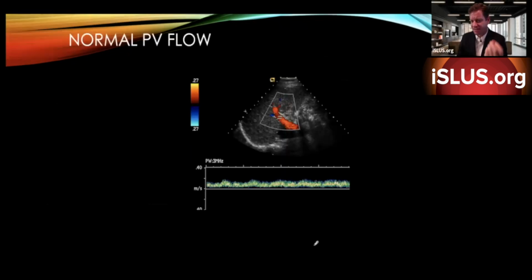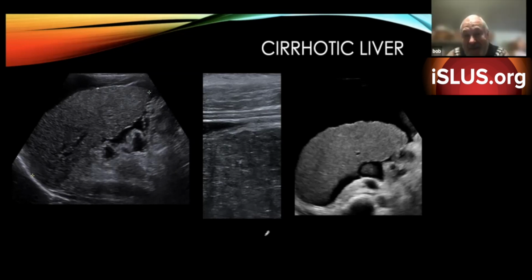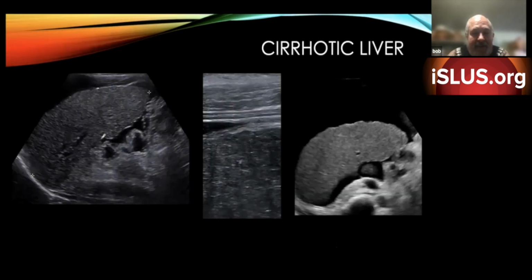And ascites is fluid, and on ultrasound, fluid shows up as hypoechoic, is what it's called in the sonographer world. Well, not really. Hypoechoic would be this: the kidney is hypoechoic to the liver. It sort of means less echogenic. There are no echoes in fluid, so we would say that is anechoic, without echoes. So black, every time we see black in ultrasound, it equals fluid, because there's nothing inside the fluid to send back echoes. Okay.